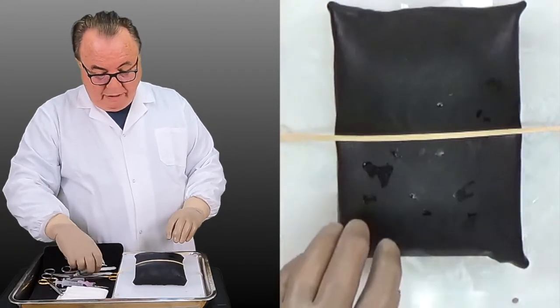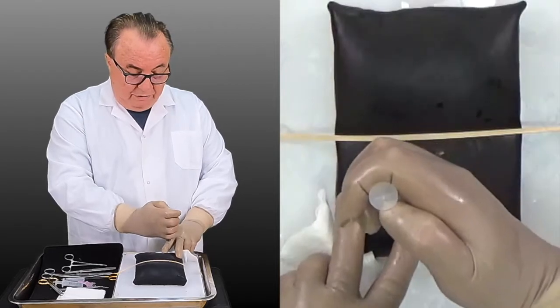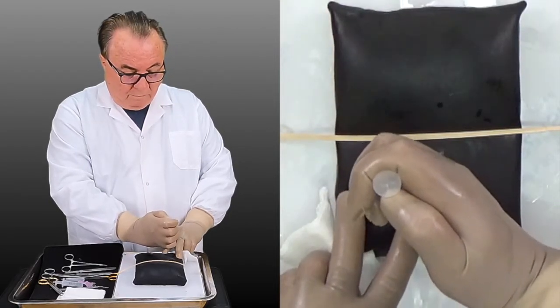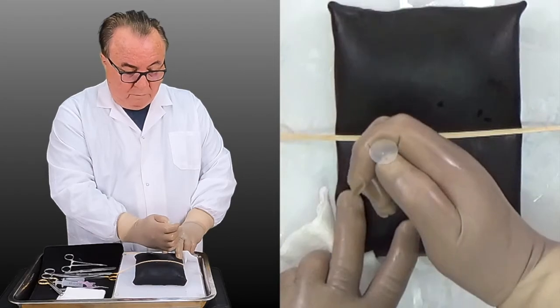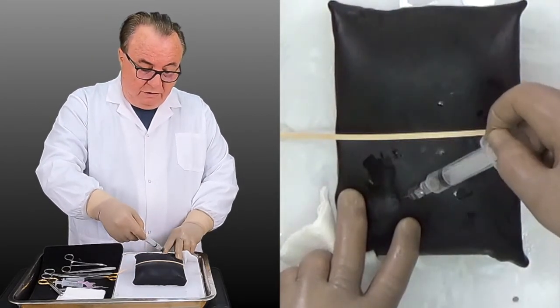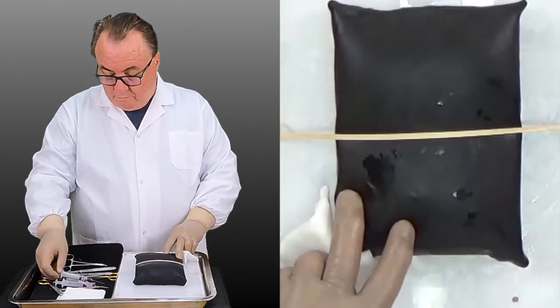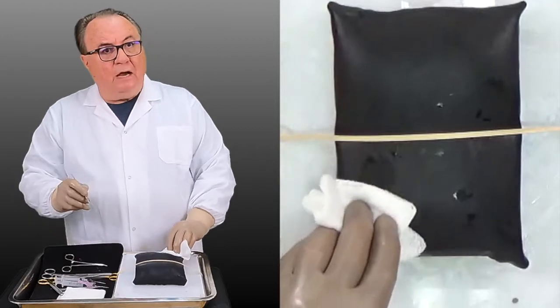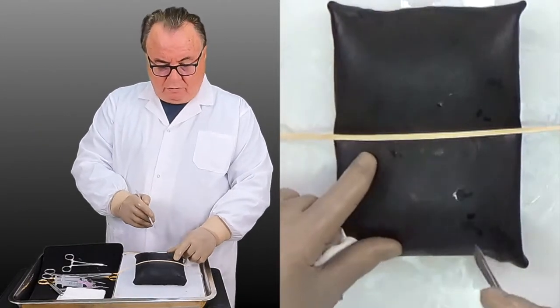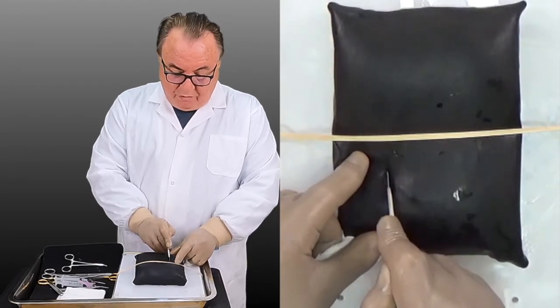Sometimes you can identify where the abscess is by sticking a needle into it and aspirating. You can see just a little bit of pus coming into the needle. Now, unlike other procedures, we don't want the skin to close, so we make a cruciate incision in the shape of a cross.